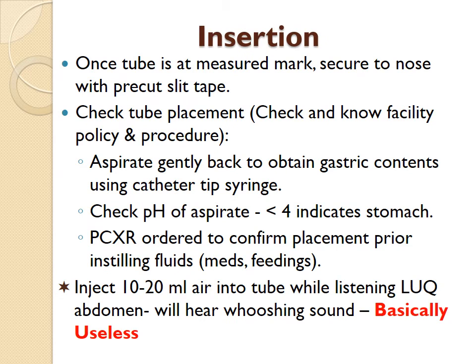Now, once the tube is at that measured mark, you want to secure it gently to the nose. You have a couple of options. You can clean their nose if it's extremely oily with an alcohol pad or so prior to doing this. You can even put some skin protectant on it, which will make it a little sticky so that the tape will adhere easier.